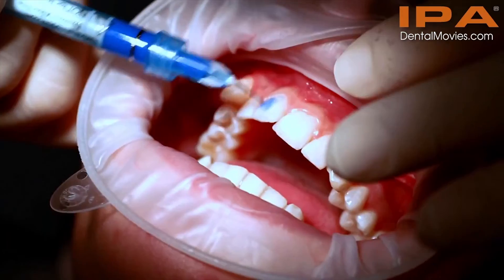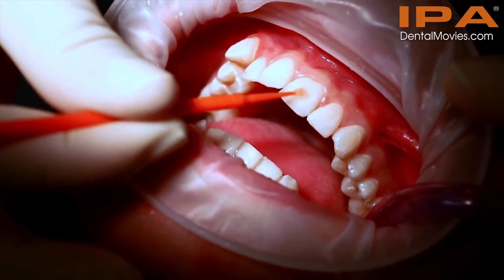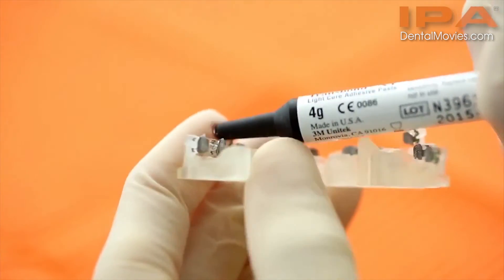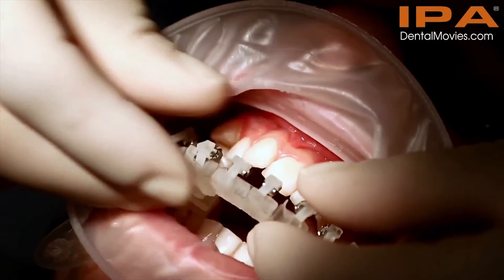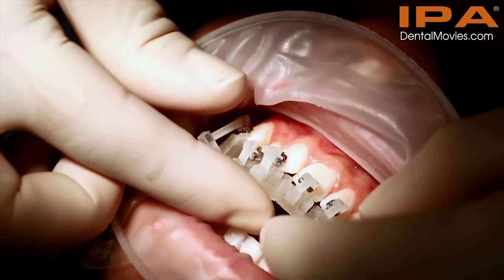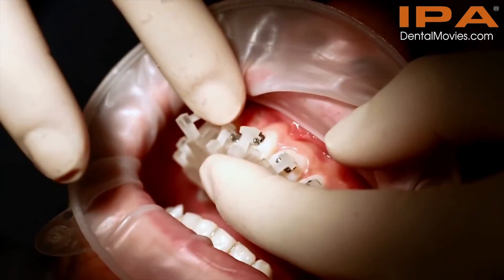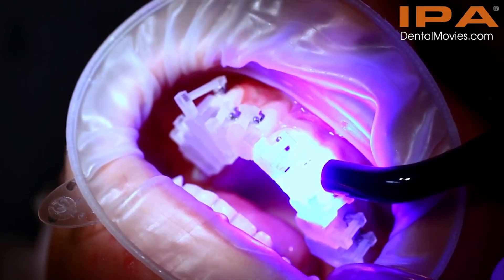Bracket bonding is performed using the typical method the office staff is accustomed to. The first stage usually involves cleaning the teeth and etching the enamel in the area of the planned bonding. The bond is applied on bracket-based pads immediately before the bonding procedure. The segmented jigs with the brackets included are positioned on the cleaned and etched teeth. The O3DM software allows for precise positioning of the brackets with the jigs exactly as planned. Accurate adjustment of the jigs to the occlusal surfaces guarantees ideal position of the brackets on the teeth. The bases of the brackets in the jigs are not covered by any elements of the jigs which makes light curing very easy.